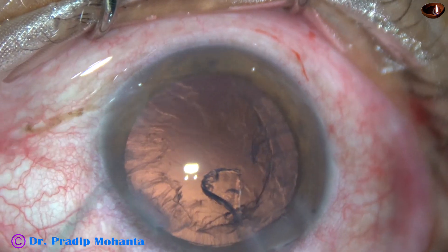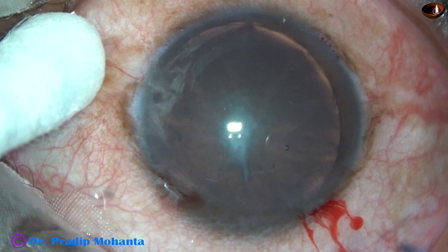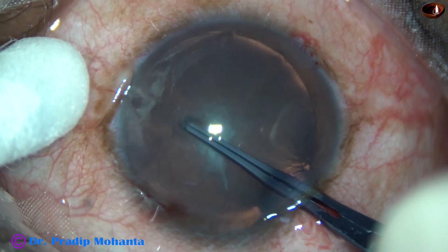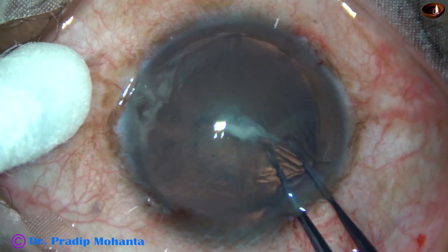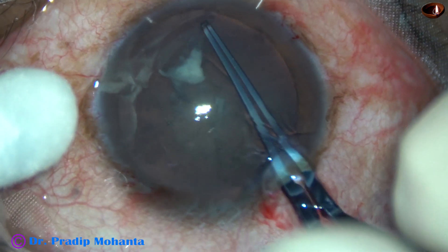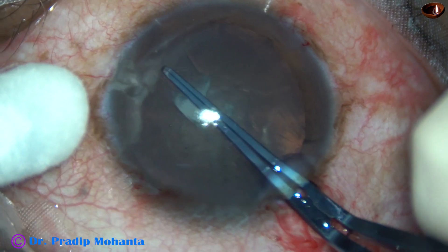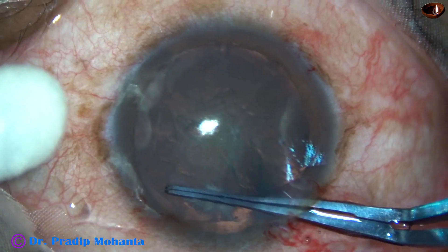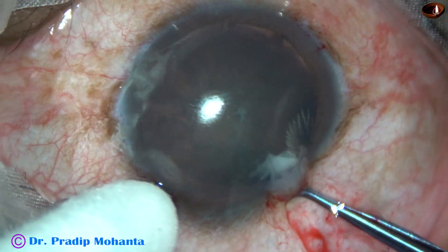And now let us see another case — a very interesting case. This is anterior polar cataract. Visco has been injected and now capsulorexis is being done. As I do the rexis, the anterior polar cataract is peeled off. There is some posterior subcapsular cataract also. In this case I am doing a large oval rexis so that management of this sticky soft nucleus becomes easy.